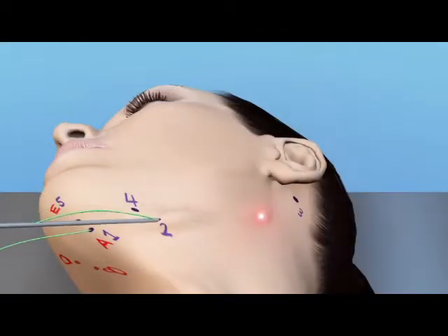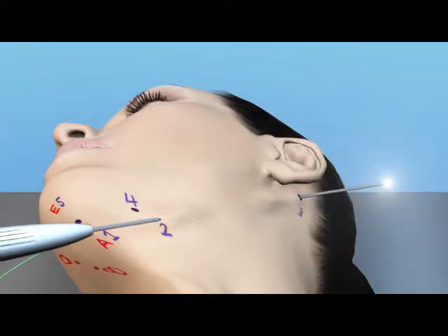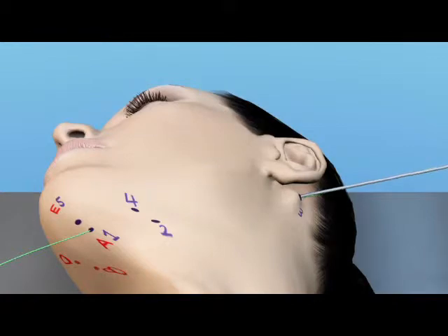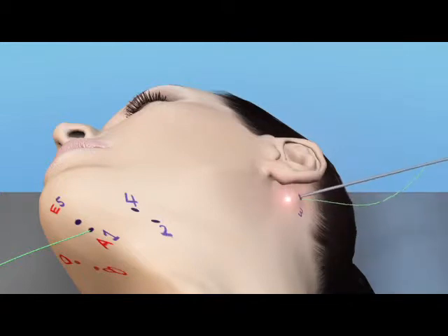The rod is then carried about and around the angle of the mandible up to point 3, where the rod is brought out until approximately 1 centimeter of the tip still remains in the subcutaneous plane. The external portion of the rod is then rotated downward, allowing the internal portion to rotate upward, oriented towards the mediocanthus of the left eye.